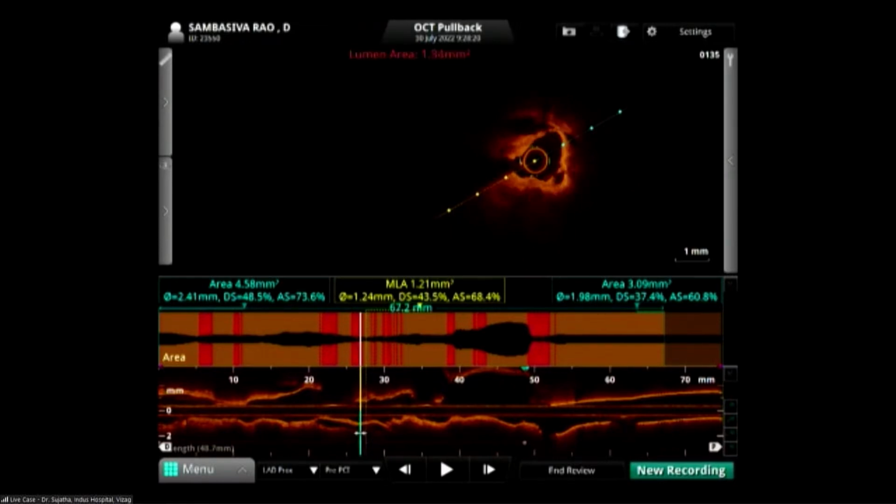If you implant a stent, the expansion will be about 68%, whereas with a calcium score of less than 4, you'll get an expansion of about 96%. So there'll be a 30% difference in stent expansion in this region, and I would still prepare it further.